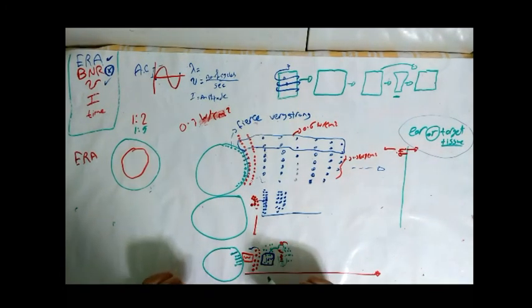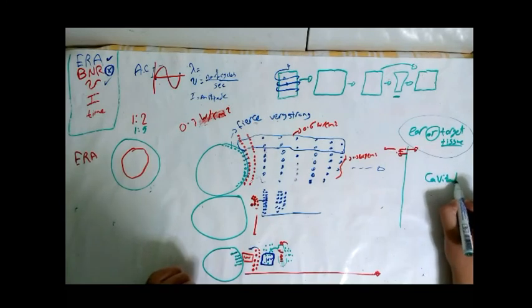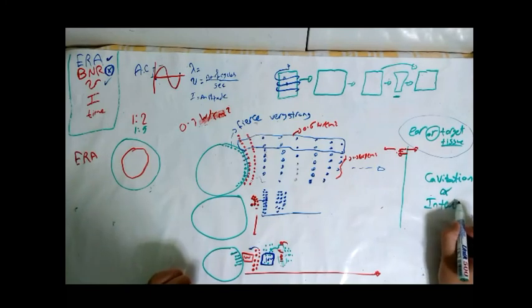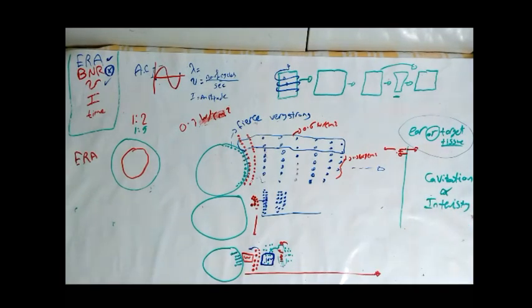A very important thing now: the cavitation which happens is in direct relation to the intensity. The higher the intensity is, the higher the cavitation is.